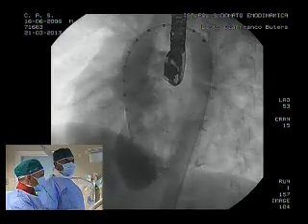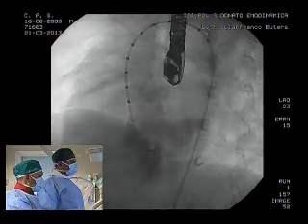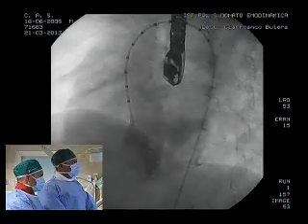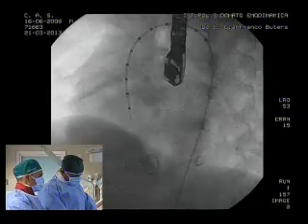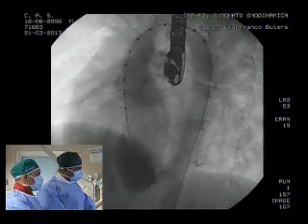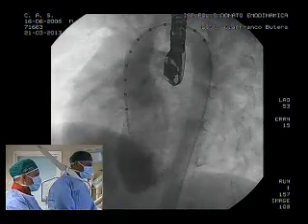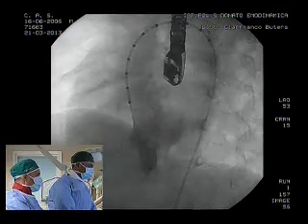This morning, Mario elected a muscular VSD device. I personally don't like it so much because I think we're overkilling on the right ventricular side. We don't need to put a big retention disc on the right ventricular side. So I would probably try a 6.4 ADO2 device myself. Honestly, if you ask me candidly, I would say it's a great case for the new device because there's not much aortic rim.